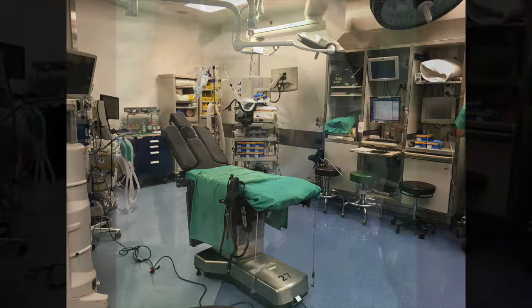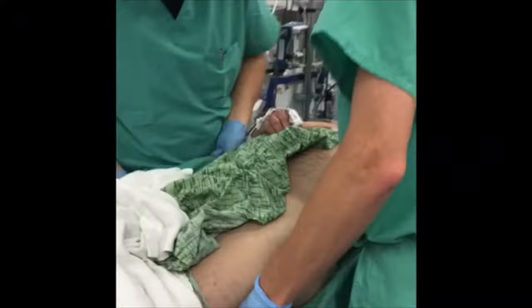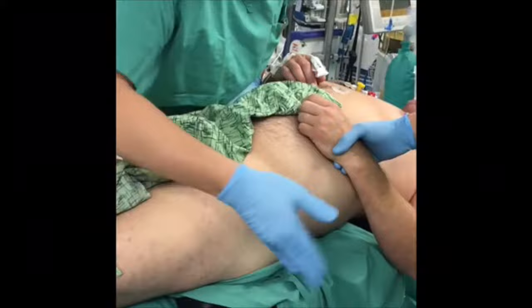The patient's lower legs are placed in sequential compression devices to prevent deep venous thrombosis during the procedure, and then placed on padding to prevent compression of bony prominences. The patient is aligned in the supine position so their greater trochanter is in line with the brake in the operating table, in order to allow flexion of the hip to prevent sciatic nerve compression and prevent them from sliding down.